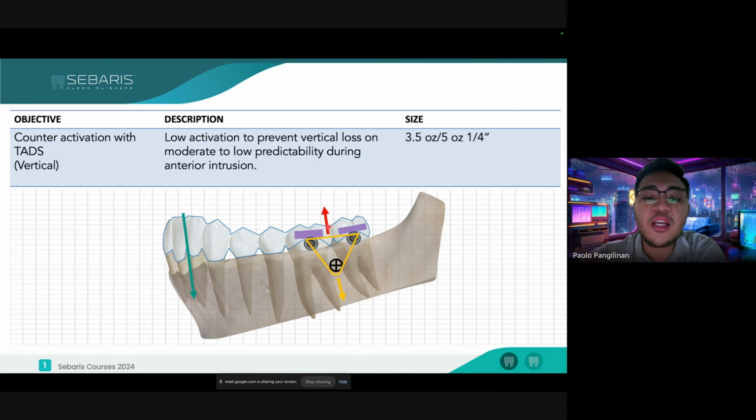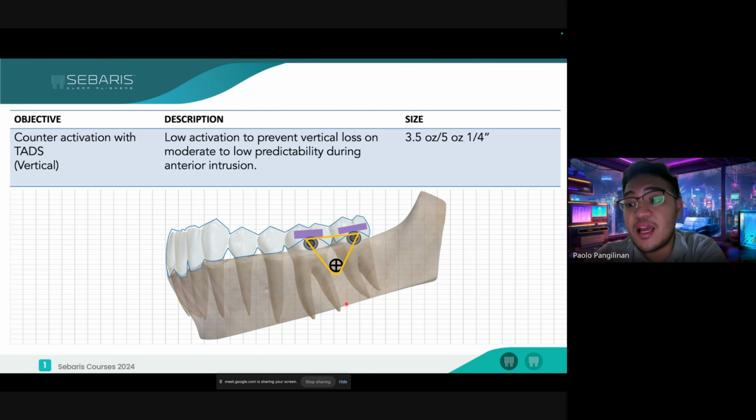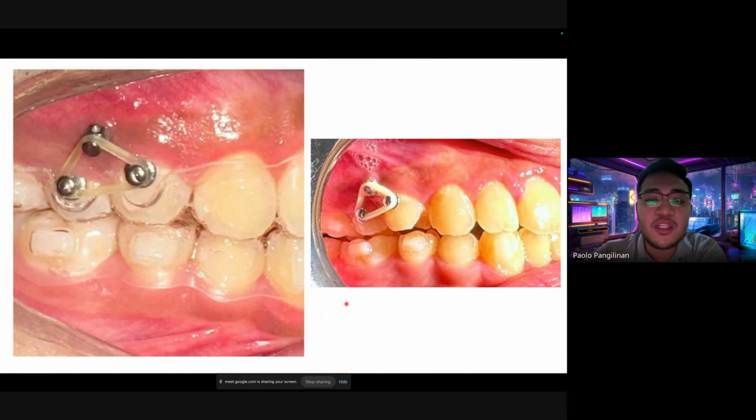Whenever your aligner engages the attachment to push it up, your pull here pulls it down. It cancels out the force, and therefore you're getting an absolute intrusion. So we don't just use clear aligners alone. We love to use auxiliaries because they help increase predictability. Here are some examples.